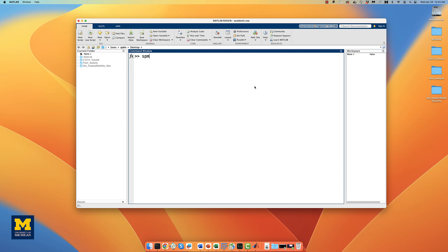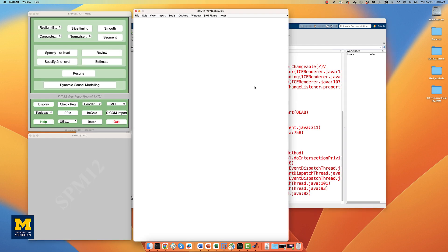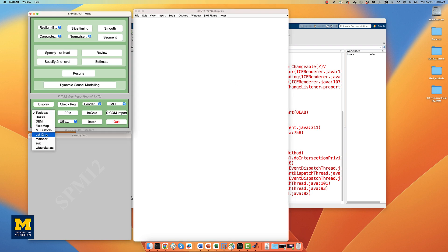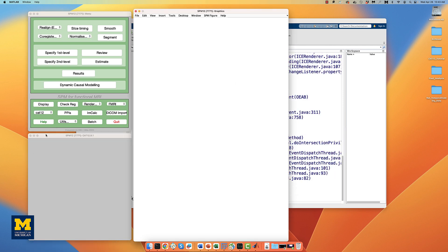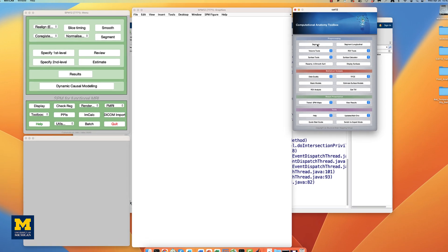If you don't already have CAT12 open, type SPM fMRI from the MATLAB command line. Once it loads, select the CAT12 toolbox from the toolbox drop-down menu and click on the segment button in the CAT12 GUI.